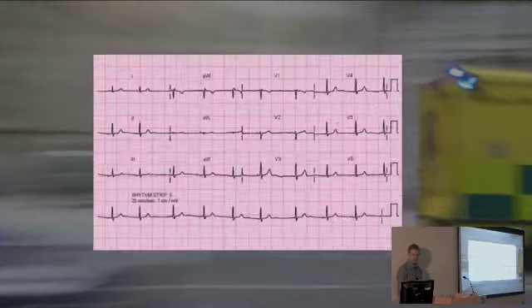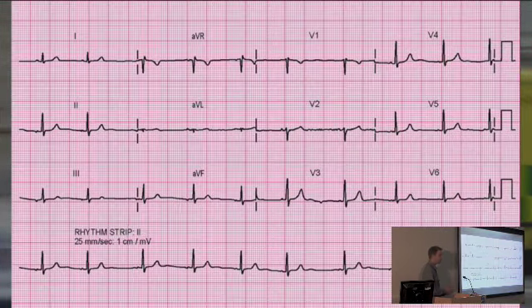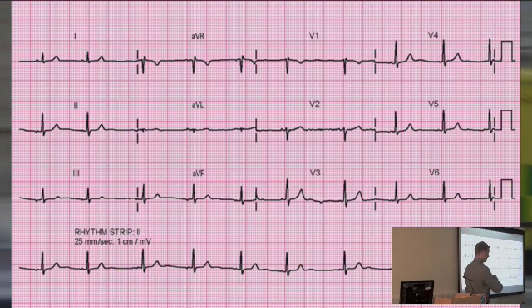Let's have a quick look at some ECGs. Start off with a normal ECG. In an OSCE, you're going to say, okay, I've got an ECG here. This is Joe Bloggs, date of birth 1/1/1910. I can see that this ECG was recorded because he had a routine checkup at his GP surgery.